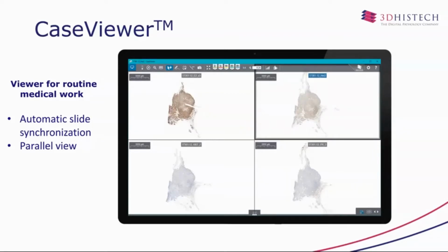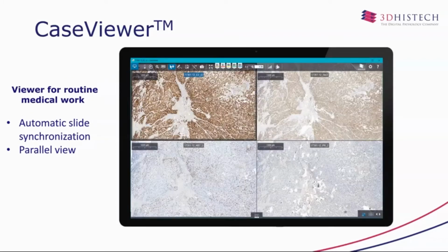After this, you can link together these slides, and basically you can zoom in, zoom out, pan and move the slides, and all the slides will move together. Basically, you can see the same area, the same tissue with different stains at the same time. I will present you this in my live demo as well.